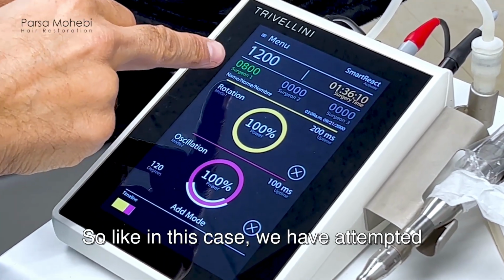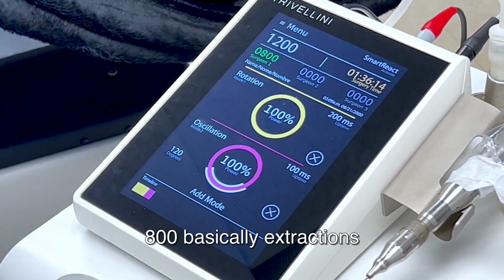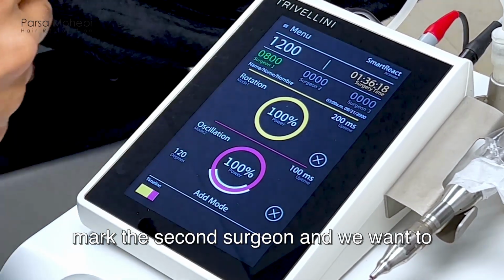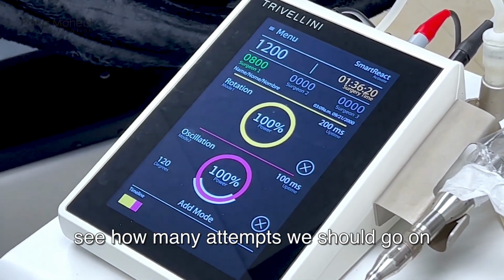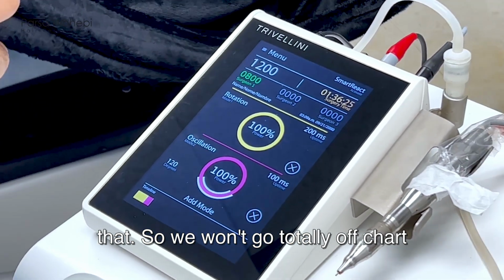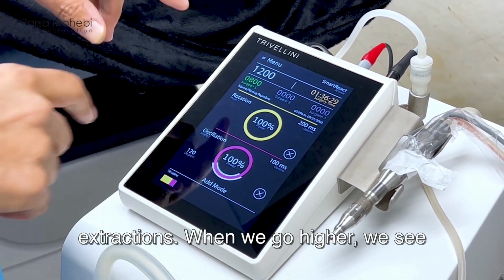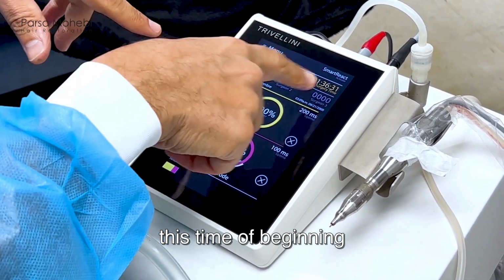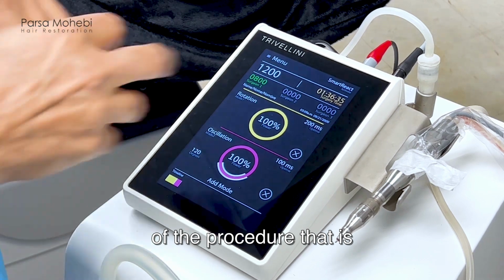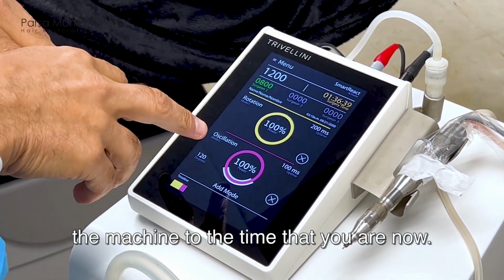So in this case we have attempted 800 extractions from the beginning of the procedure, and for the second phase we're going to mark the second surgeon, and we want to see how many attempts we should go on that, so we won't go totally off chart or lose track of our extractions. When we go higher, we see the time from the beginning of the procedure, marking from the time that you turn on the machine to the time that you are now.